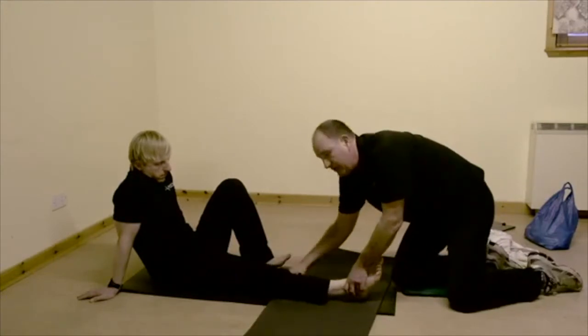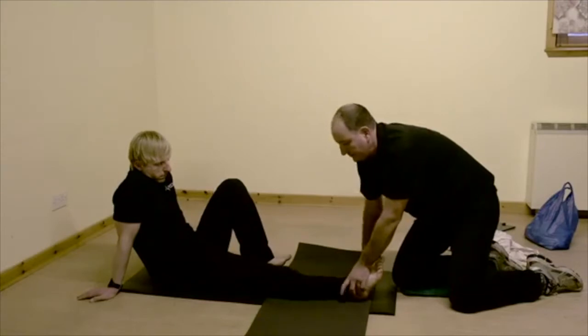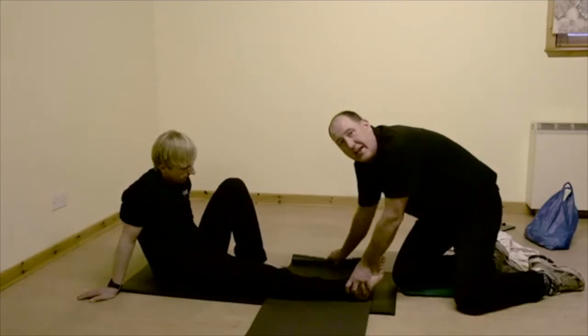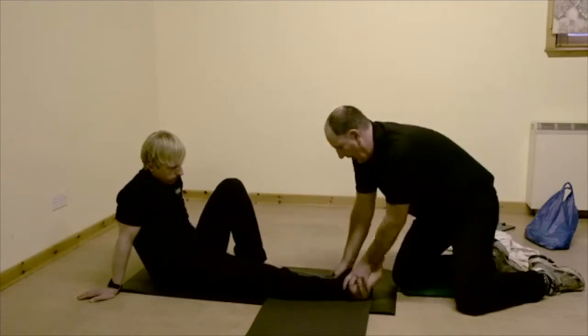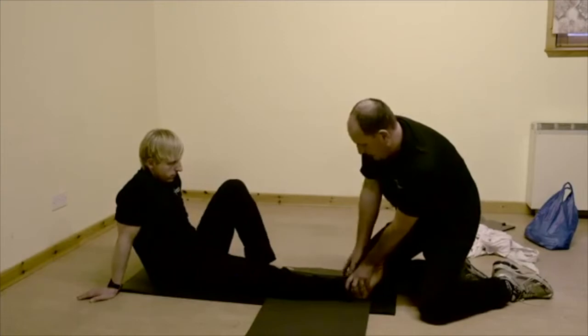I'm going to make sure that I've still got the foot inside the roll mat and keep everything stable, and then I'm just going to roll up the end of the roll mat as tightly as I can, nice and firmly, and put that right up towards the casualty's leg. I'm going to keep that in place just with my knee.